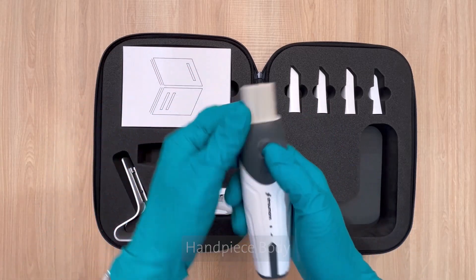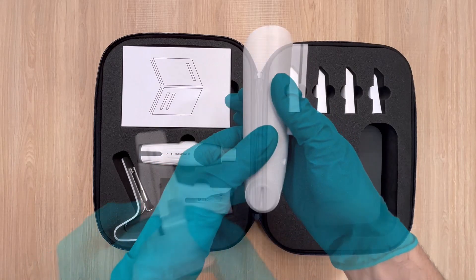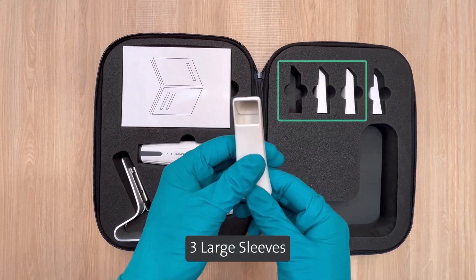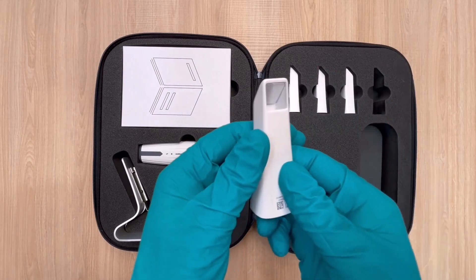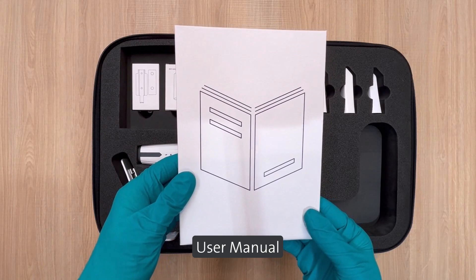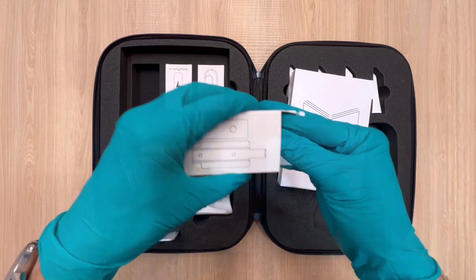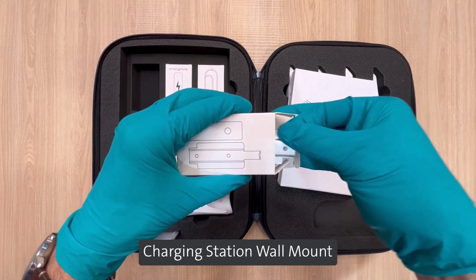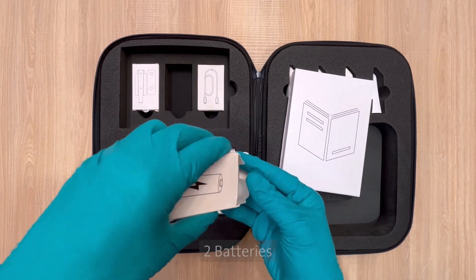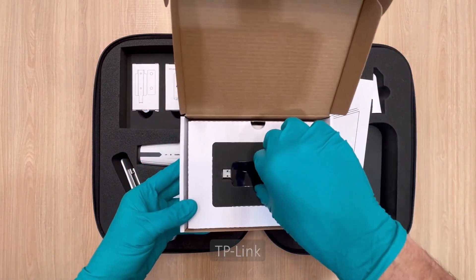Inside you will find: handpiece body, charging station, charging station desk mount, three large sleeves, one small sleeve, and a user manual. You will find other components under the user manual: charging station wall mount, plastic coin to open the battery compartments, two batteries, USB-C cable, and TP-Link.